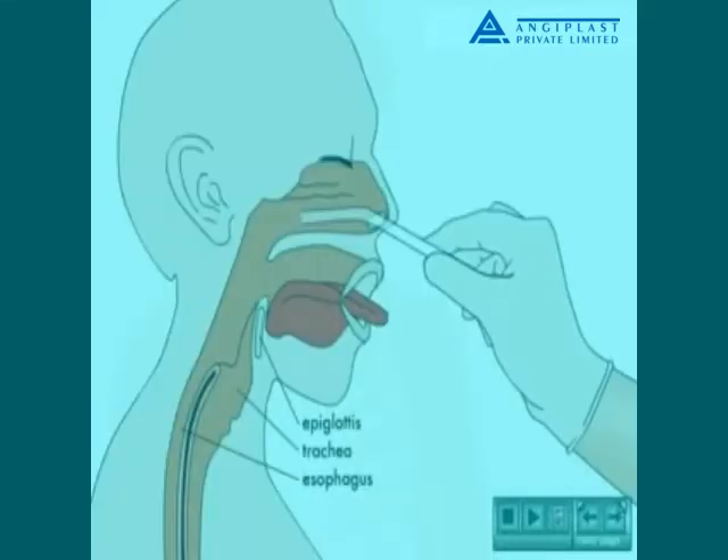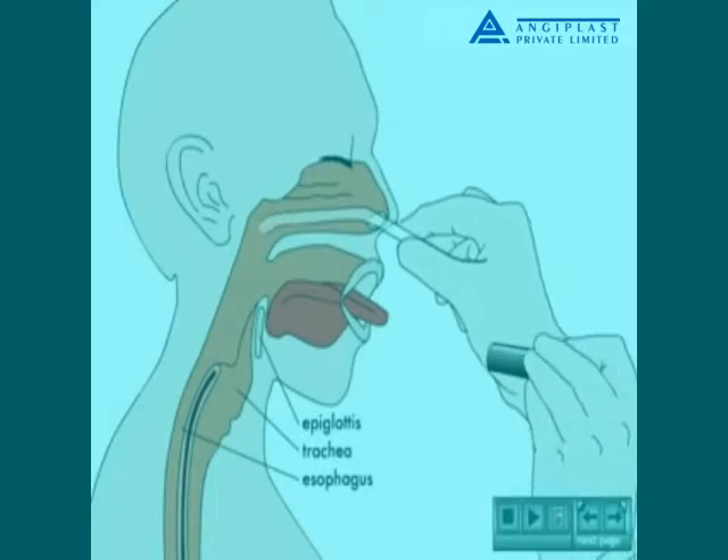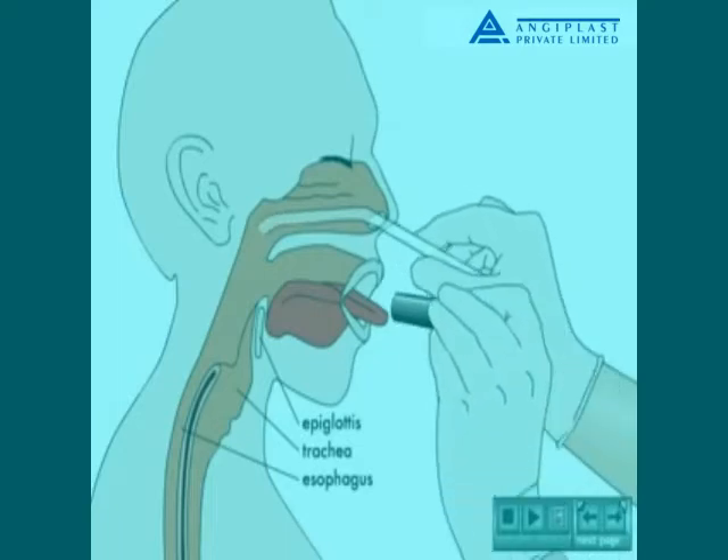The tube is marked, or a pre-existing colored band is noted. The tube tip is lubricated and then passed into a clear nostril. A pin light is used to inspect the back of the throat to ensure that the tube is passing into the esophagus rather than coiling up in the mouth.